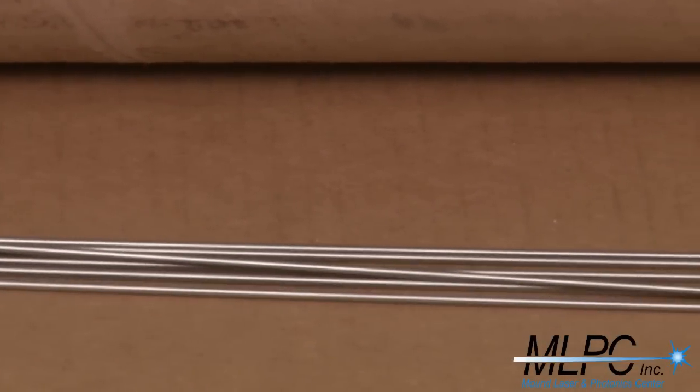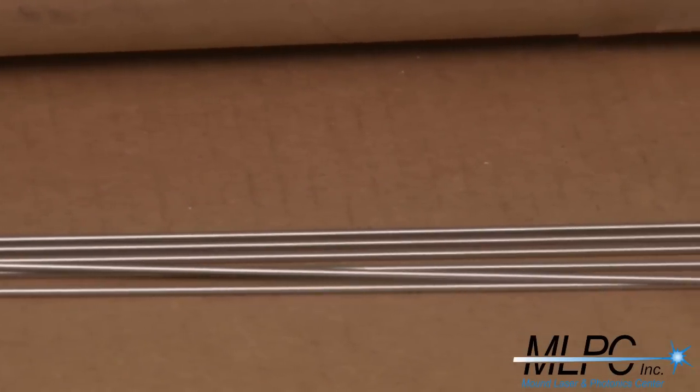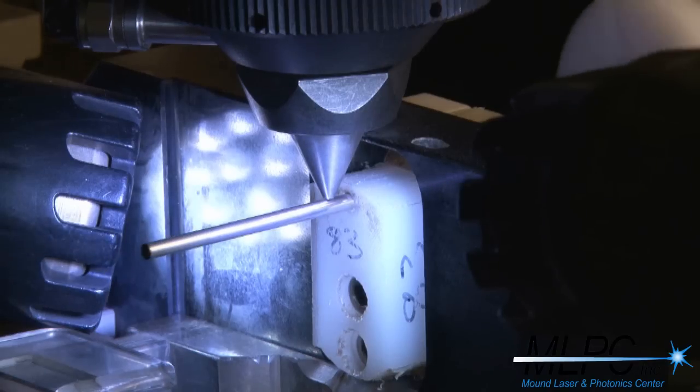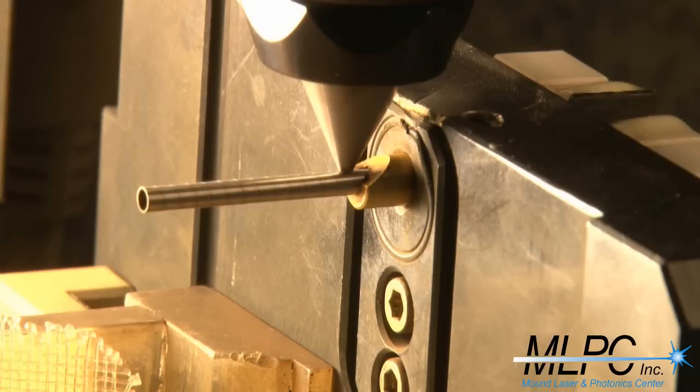The process starts by selecting raw material. The hypo tube for this is 95 thousandths OD for the larger tube and 83 thousandths OD for the smaller tube. The smaller tube is cut into one and a half inch lengths. The larger tube is first spiral cut for an inch down the part, and there are also slots cut into this part. The entire part is three inches in length.